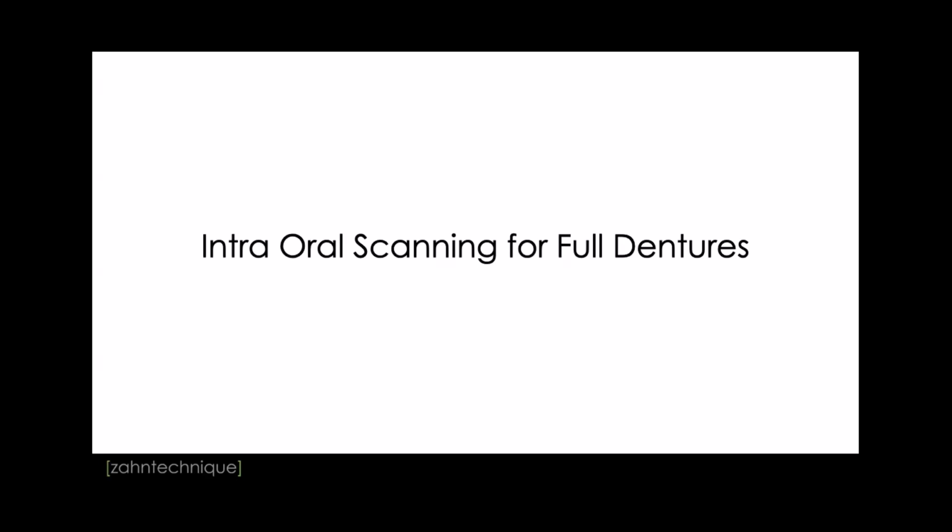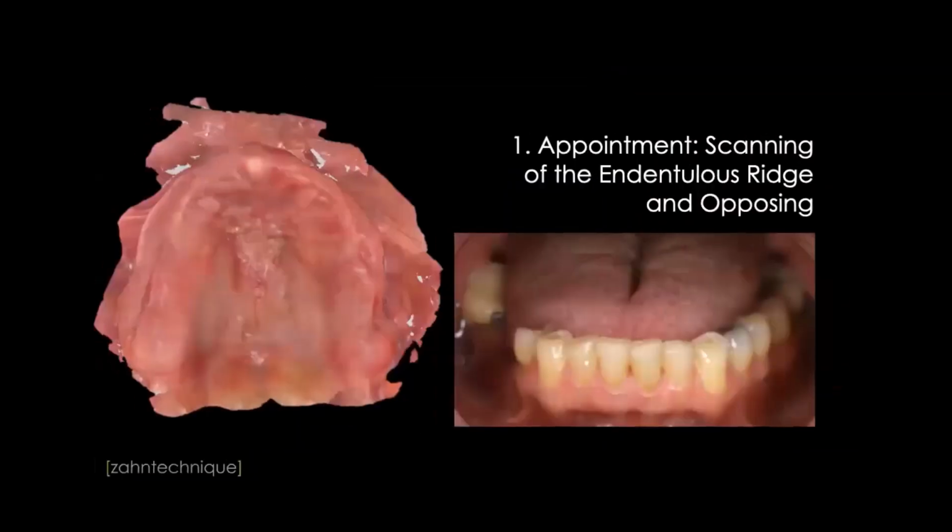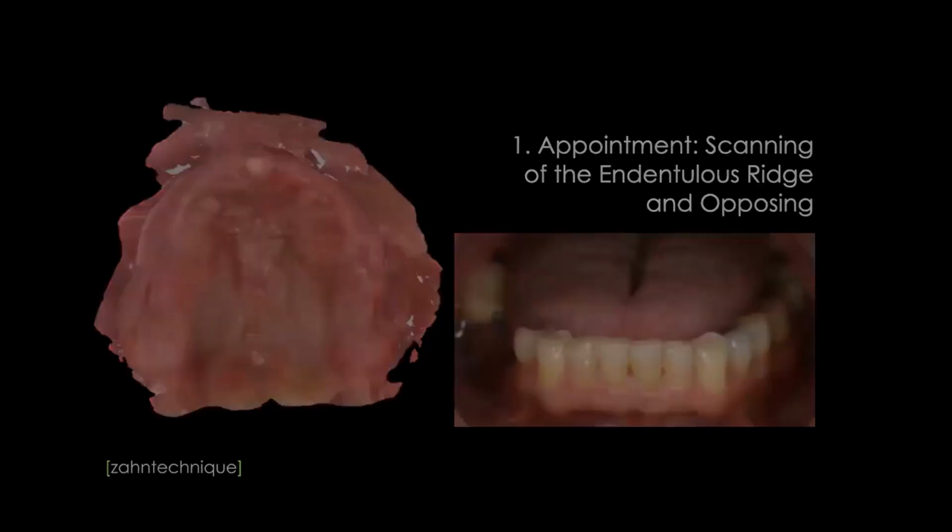And I also want to say thank you so much to Devon from Align. She kind of sent a couple slides to me to utilize for the scanning protocol for denture scanning, which really is very helpful. Amazing slides, by the way. Thank you, Devon. So what I appreciate on digital dentures and intraoral scanning in combination is we have less appointments. Yes. So the first appointment is scanning of the edentulous ridge and opposing, right? So let's say we just do the upper, right? And have lower teeth still.